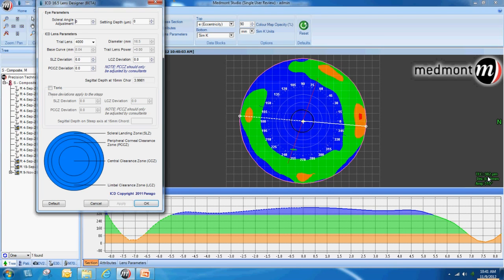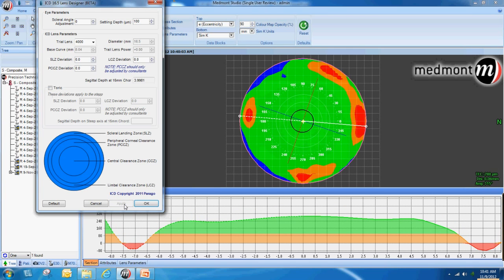When the lens is dropped on eye, we want approximately 300 to 400 microns of apical clearance, because we know scleral lenses will sink by approximately 100 to 150 microns. Therefore, with our initial 382 microns of apical clearance, we have the desired initial apical clearance. However, we know that lenses will settle by approximately 100 microns. So let's model the settling of our scleral lens by this 100 micron margin and determine if the lens will drop into peripheral corneal or limbal bearing.